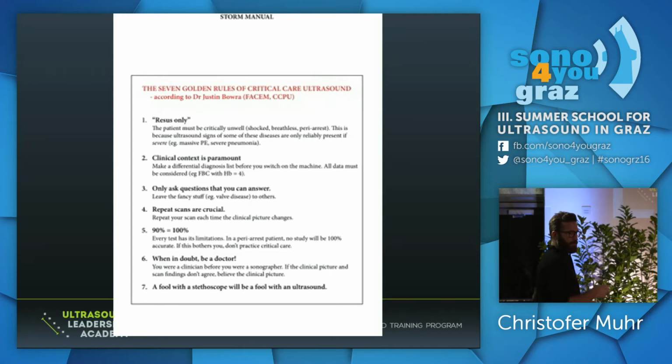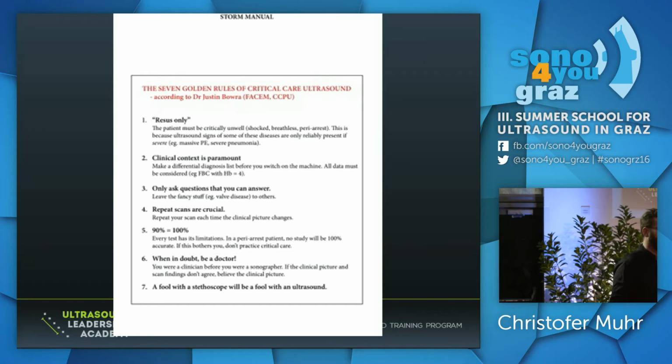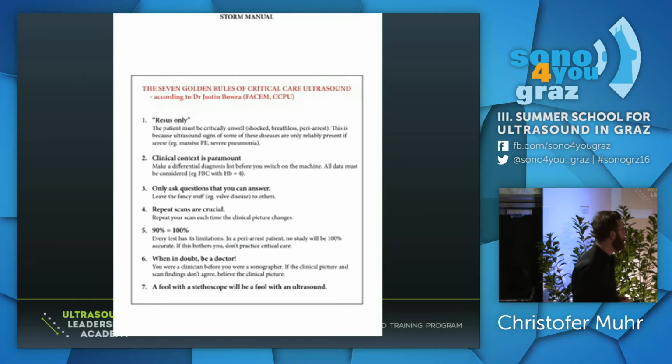And this also, right? Focus on what you know and what you can actually find. Sometimes we find something very strange and we can save a clip, or actually see it for the first time and come up with it. But first of all, focus on what you know that you can actually see and find.